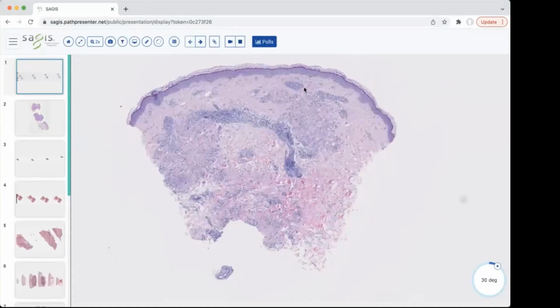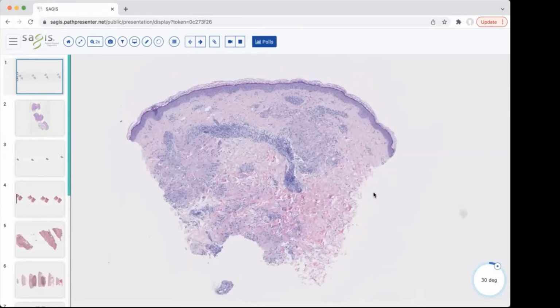I think the big key point when you're thinking about granulomatous dermatitis is to remember that there's a big overlap in diseases in dermatopathology and in dermatology clinically. Some of these diseases you'll try to ram into one category and maybe there's an overlap or bleed over into another. And that's okay. If you know the salient features, you'll be able to get to the diagnosis the majority of the time. I also like to talk about the clinical morphology of these lesions. Most of these diseases will have minimal surface change, and they're really either plaques or nodules. So with that, we'll go ahead and get started on this first case.